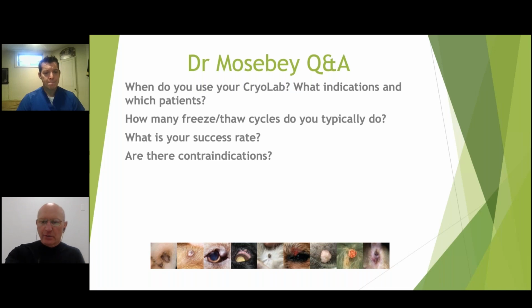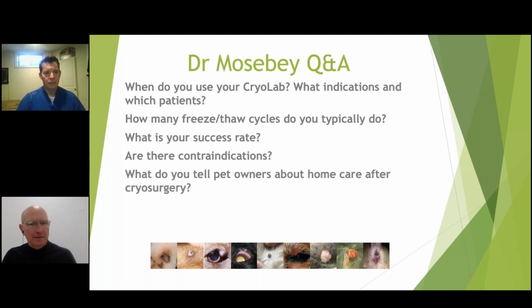Okay, great. So there's just two more questions here that we'll cover today. What do you tell pet owners about home care after cryosurgery? Leave it alone. That's a big one.